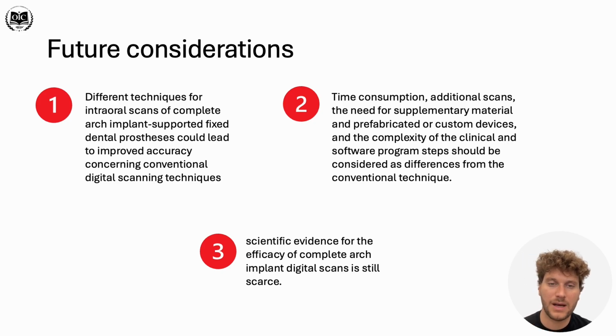But bear in mind that we make our workflow a bit more difficult and time consuming because of the extra scans, supplementary scan bodies, and prefabricated or custom-made devices. Also, the knowledge of the dental technician and dental professional should be up to standard to utilize all these things.